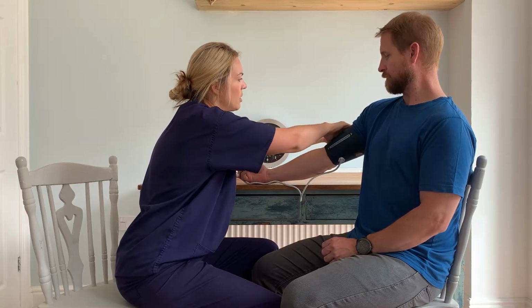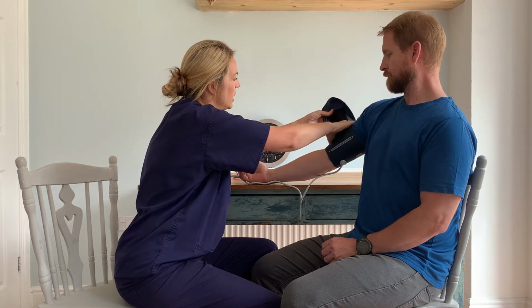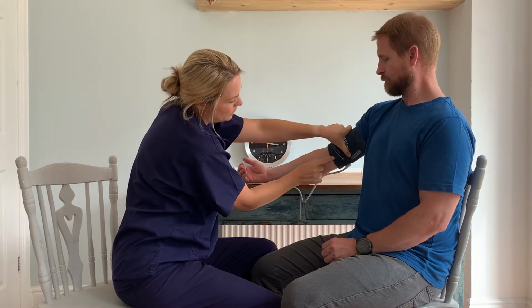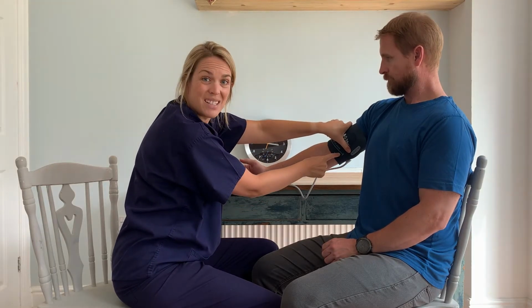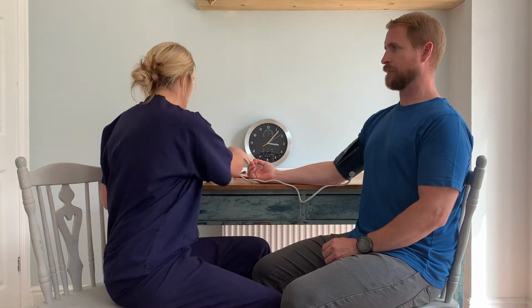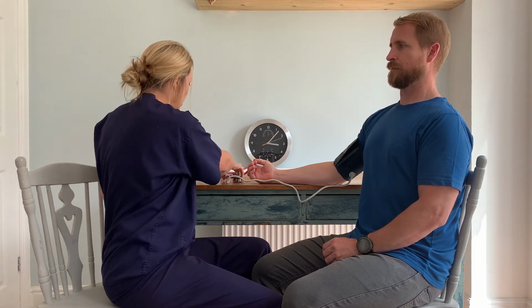I'm just going to put this cuff all around. Being mindful of clothing in the way, as I said, making sure that's removed. And I'm looking for the artery marker to be within these 2 lines here, which indicates it's the right size cuff for my patient. So if you had a cuff that was too big or too small, it could give you an inaccurate reading. So what we're going to do now is we're going to estimate the systolic blood pressure.